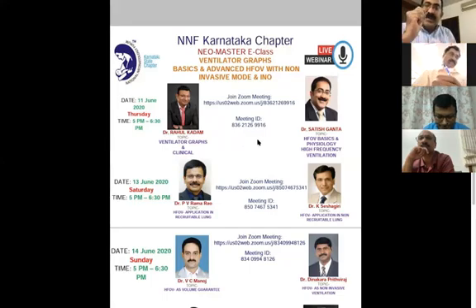Number two, once I've done that, I've hooked the baby onto the ventilator, so I do my clinical things. Very, very important, 4 things which I use. Clinically means looking at the baby, that means inspection. Number 1. Number 2, palpation. How do you palpate? That is important. So these 2 in terms of your clinical aspects.